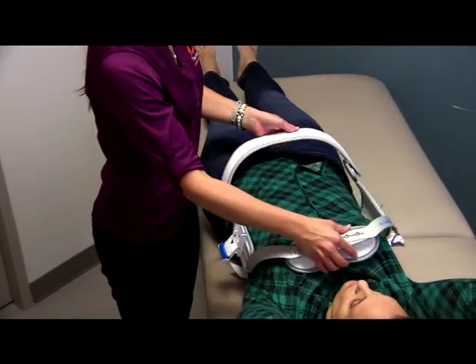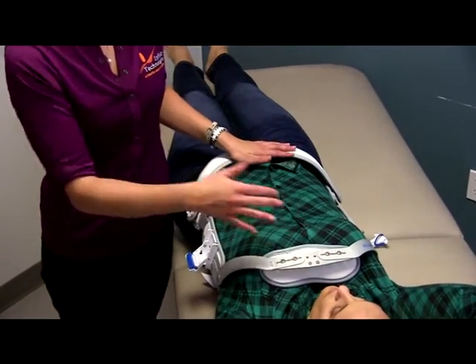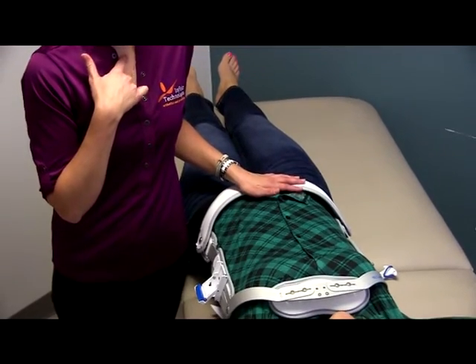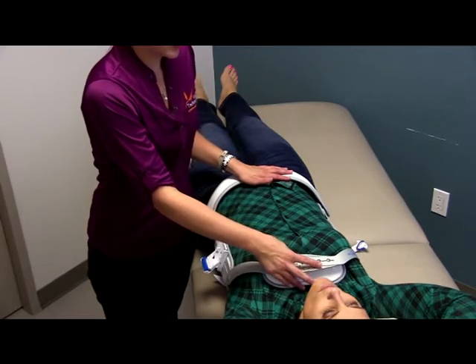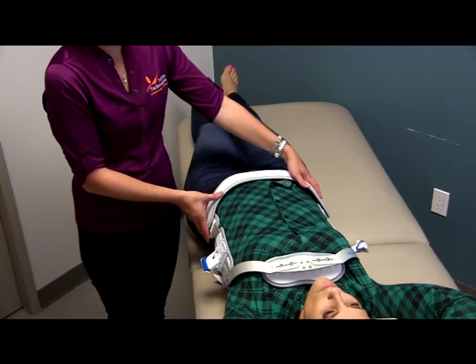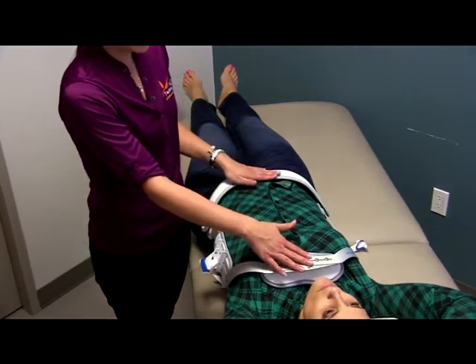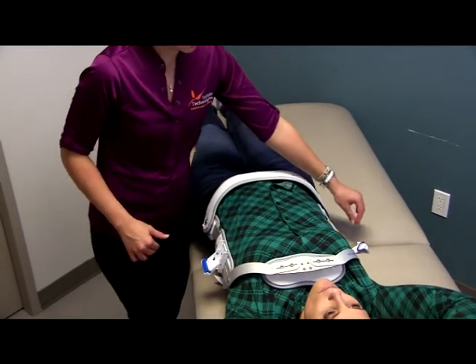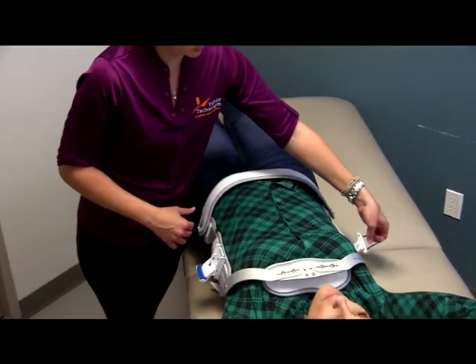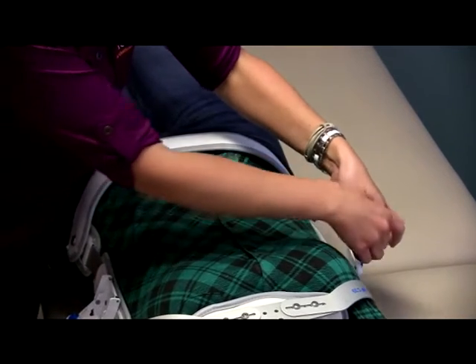Then we're going to place the front portion of the brace on her. The chest piece should be just below the patient's sternal notch, which is the soft part of the neck right above the chest bone, lying directly on the chest bone. The lower portion of the brace should be coming across the patient's hips. Once we recognize that it's in the right place, we can come to the far side where that plastic loop is located.